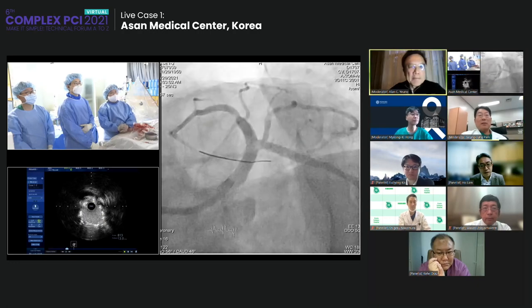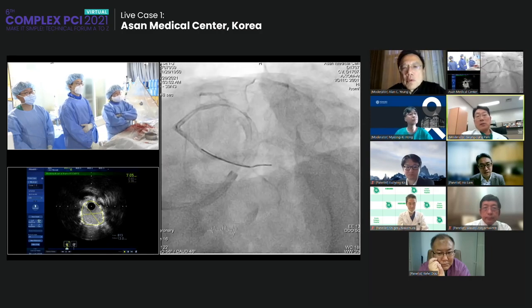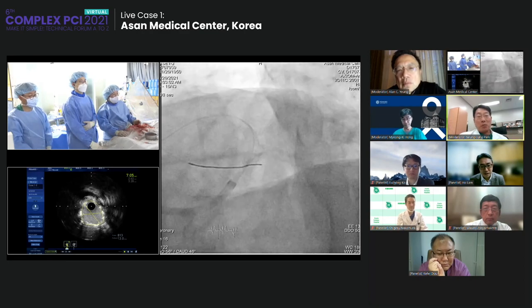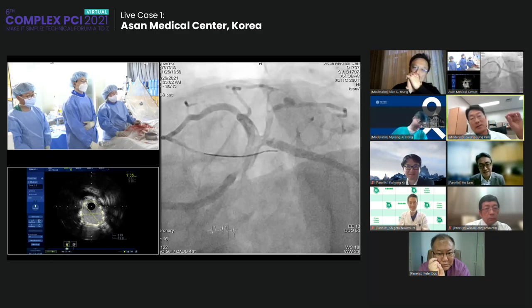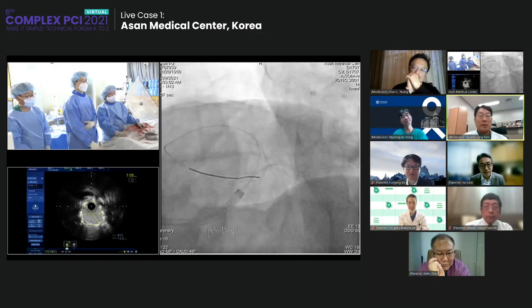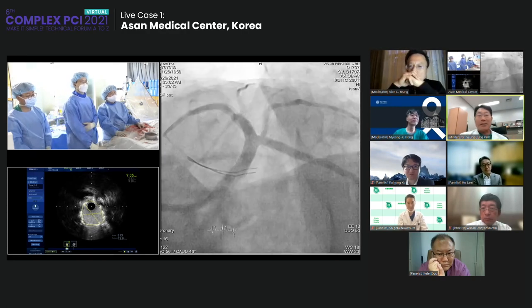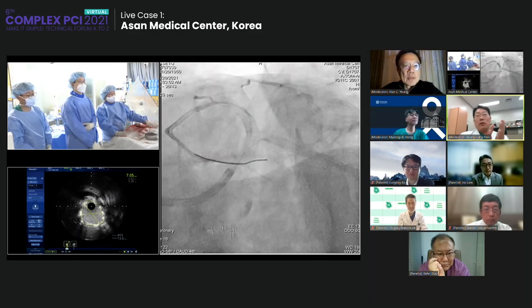All right, great. Dr. Han, it's really, really good cases. Actually, these two complex left main cases gave us, personally, I think, the message that left main disease is not anymore a surgical disease, right? Yes, as we discussed a lot before the procedures, the complexity, the distal landing zone, et cetera. However, finally, with a big vessel and big stent area, we're going to make very good long-term outcomes, less than 5% TLF or something like that. That is another personal opinion, a bias. Anyway, that's really good cases. Thank you for your contribution.